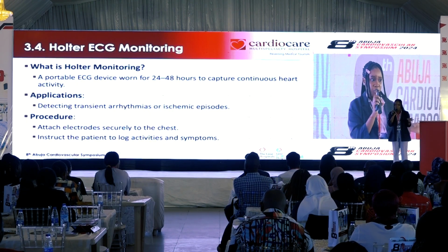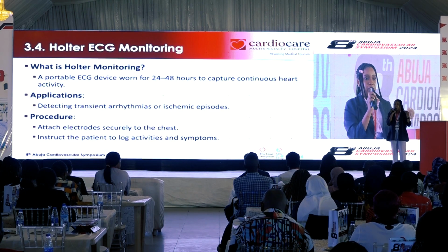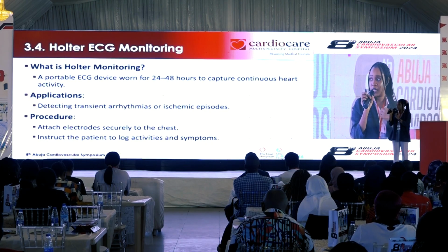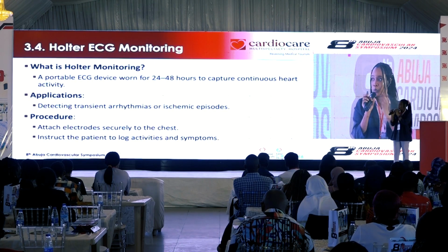So the procedure is pretty much easy. It's just like running the ECG, but the leads are different and we don't put them on the arm like I showed in the ECG. So we have to attach some electrodes, then we strap them on properly.